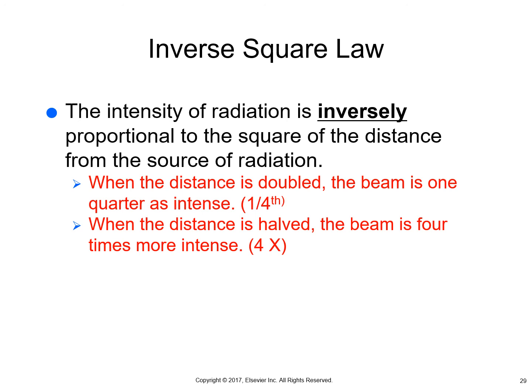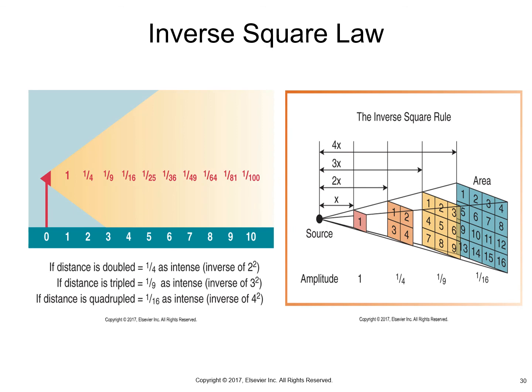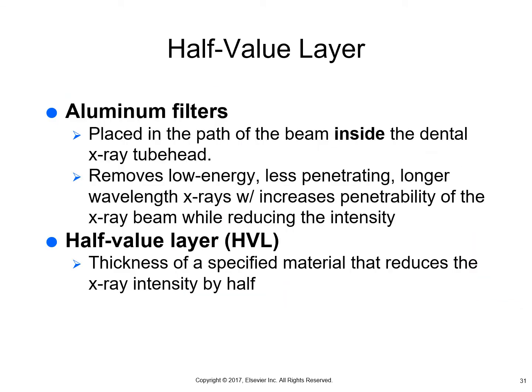When we're in lab together, I will go over this with you guys, and we'll do some of these problems so that you can actually see this in person. So don't worry about it. Like I said, there's that little worksheet that I have on the module if you want to play around with it. The last thing that they discuss in this chapter is the half value layer.